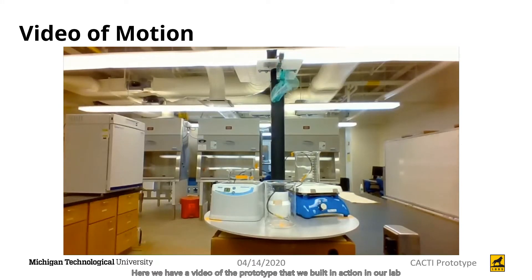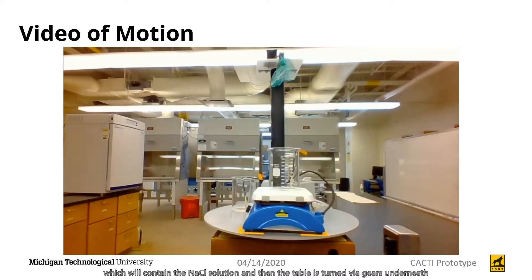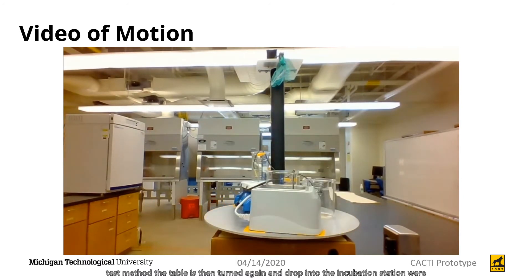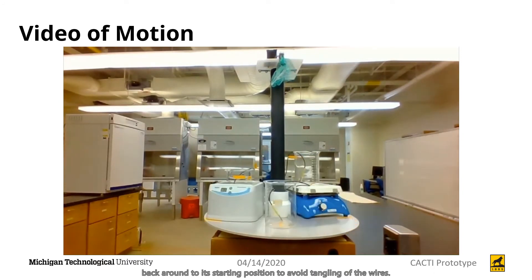Here we have a video of the prototype in action in our lab. You can see that the sample is dropped into the first beaker containing the NaCl solution, then the table is turned via gears underneath using a stepper motor, and the sample is then dropped into deionized boiling water. Once that has cooled down to 37 degrees Celsius, following the previous test method, the table turns again and drops the sample into the incubation station, where we use a water bath to incubate it at 37 degrees Celsius instead of an oven for ease of input and output. The table then moves back to its starting position to avoid tangling of wires.